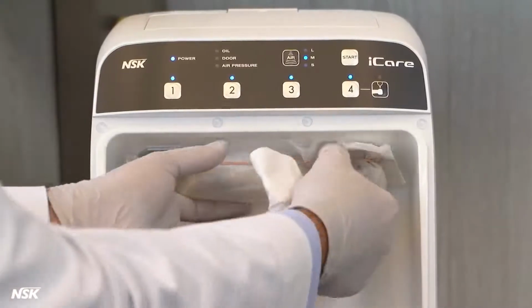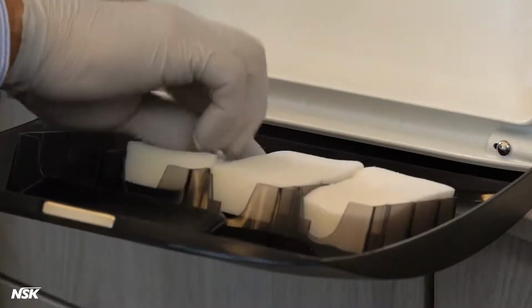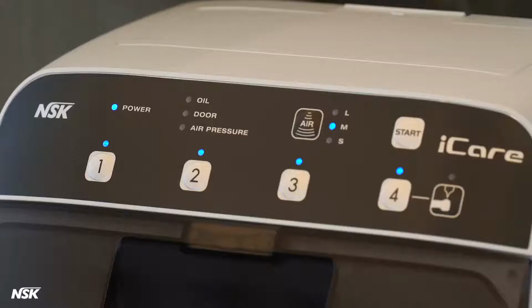Open the front door and remove the paper towels. Clean up the chamber and place new misting sponges and absorbent sheets. Your iCare is set up, primed, and ready to operate. Now let's go over the 4 buttons on the control panel.